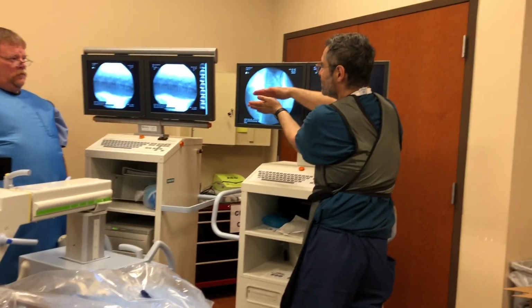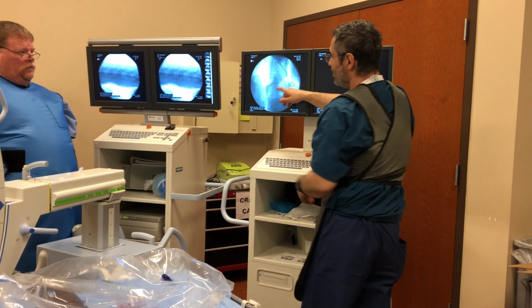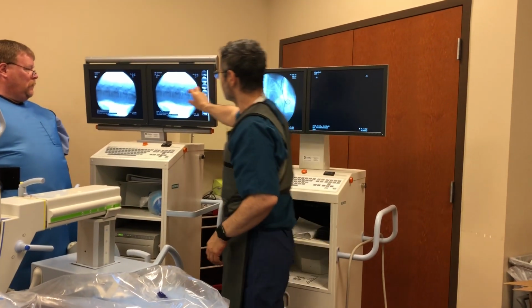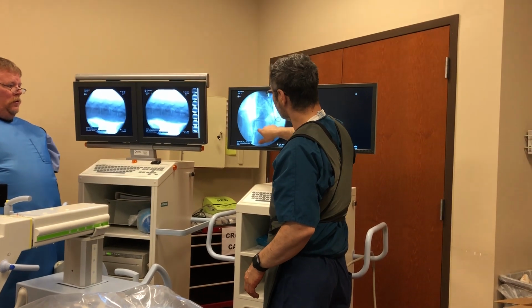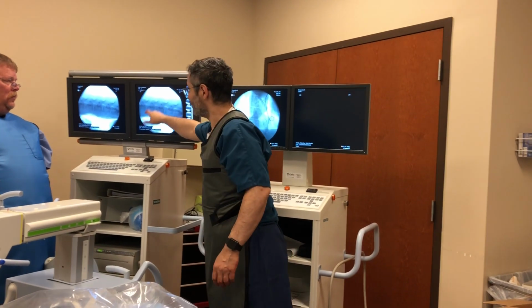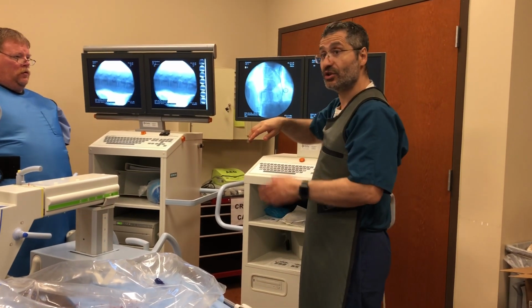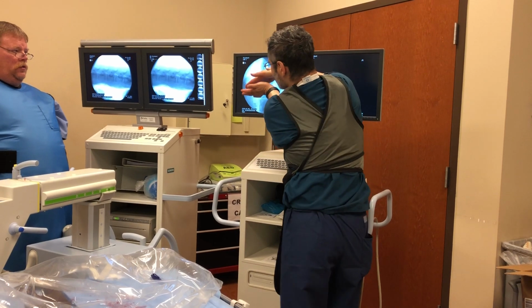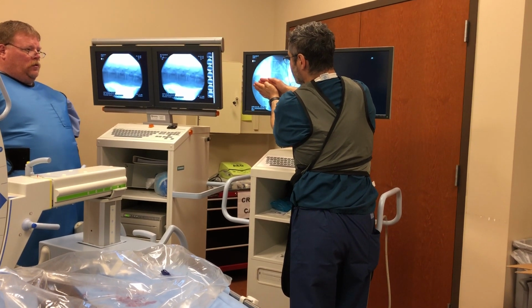It matters that you see the trajectory of the end plate. Even here you see that's a straight spine, so you can get the end plate at every level. In a human, because of the lordosis, you wouldn't be able to get that. But as long as at every level you see the trajectory, if the trajectory is here or here, it's okay. That's absolutely what you need to know.